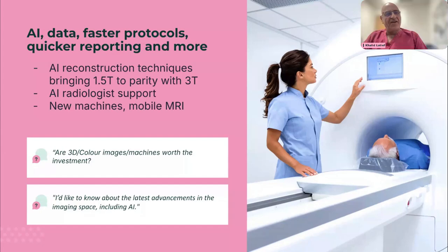So color images, well, it depends what scan you're talking about. I think with MRI, I don't think they're worth the investment right now for color images. Let's take that off the agenda. Certainly 3D images, ultrasound, you can do 3D imaging, 4D imaging as well, actually, especially for baby scans.